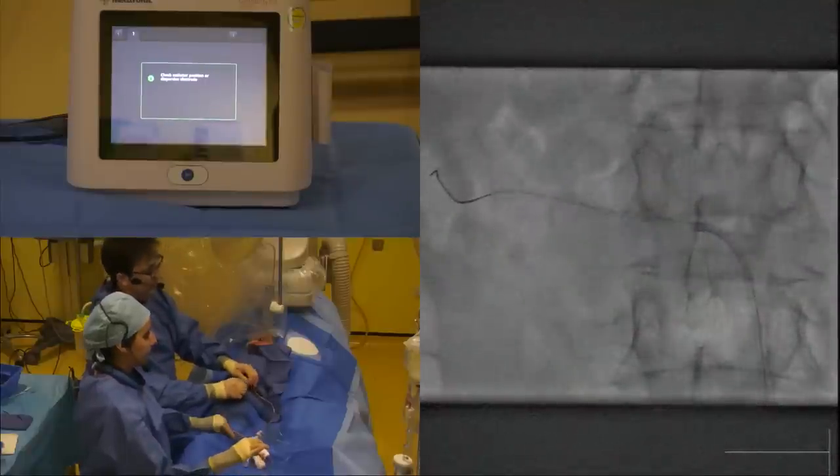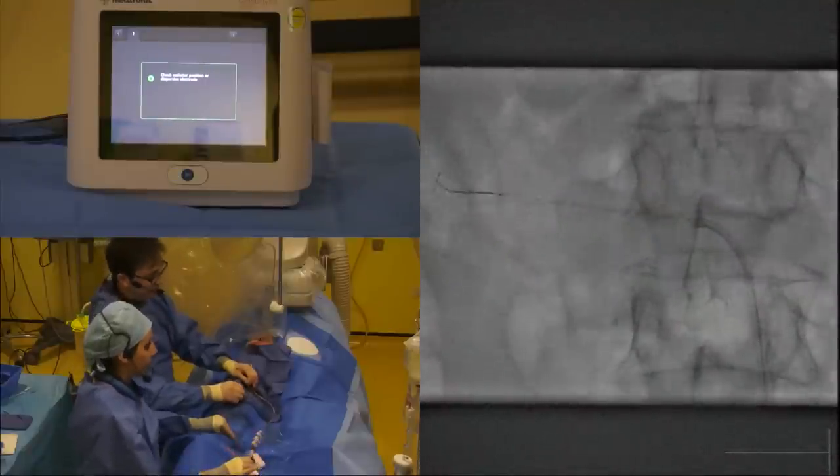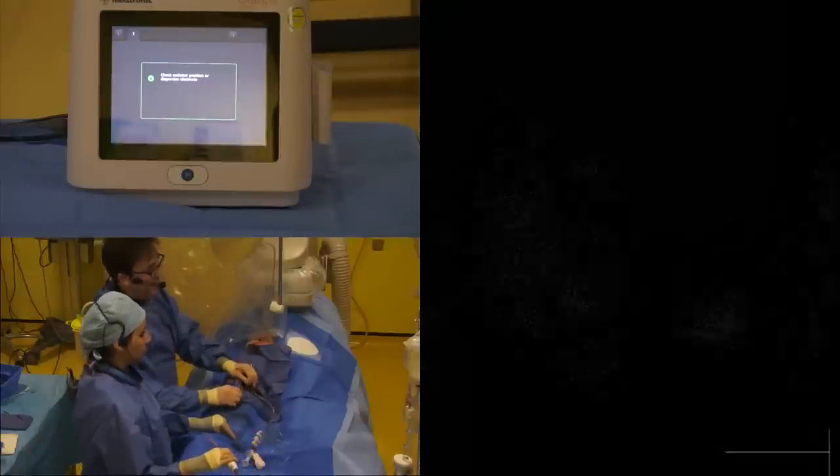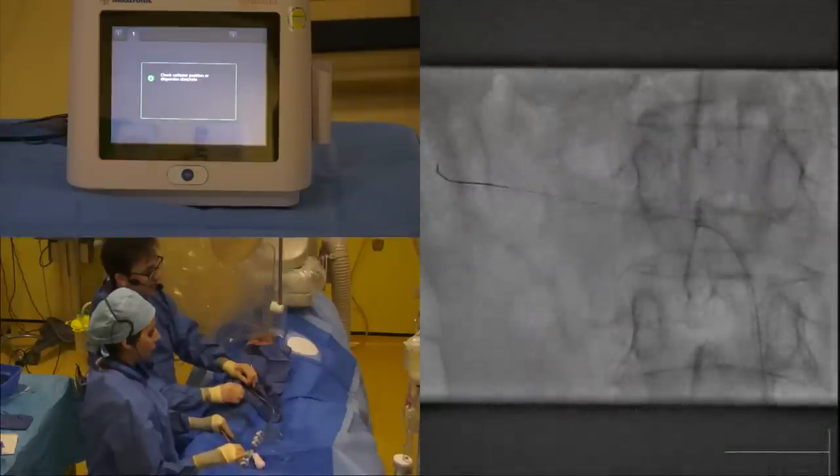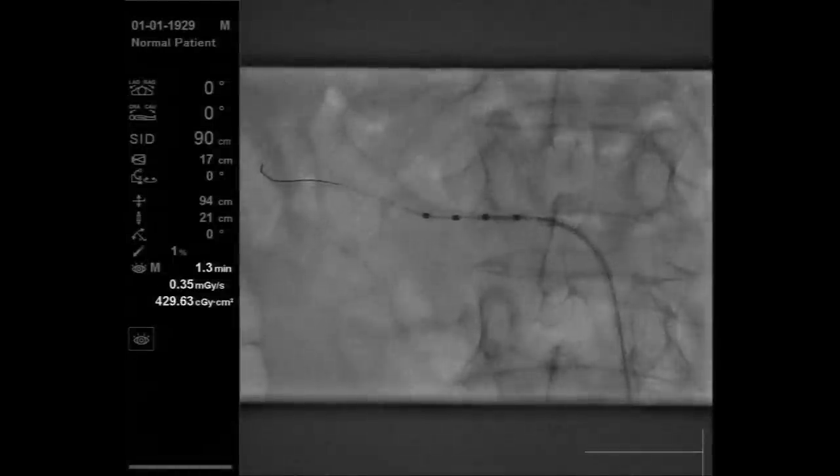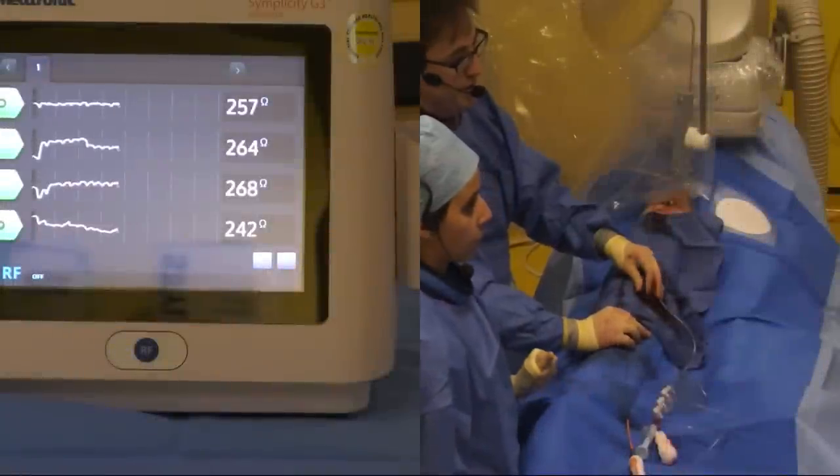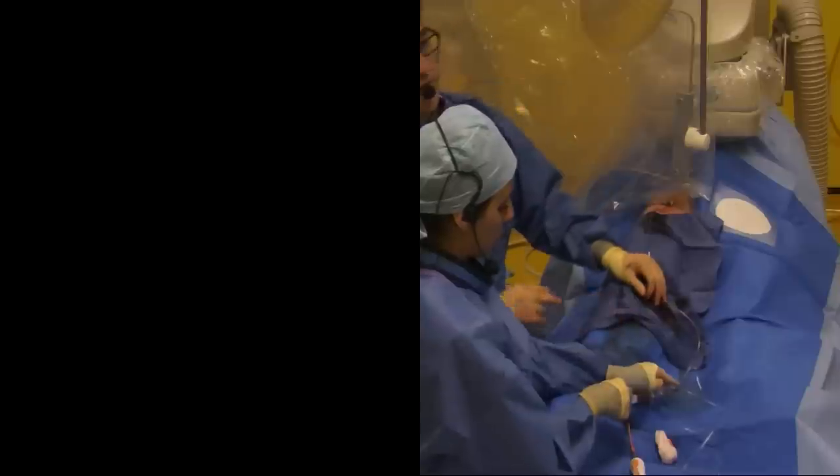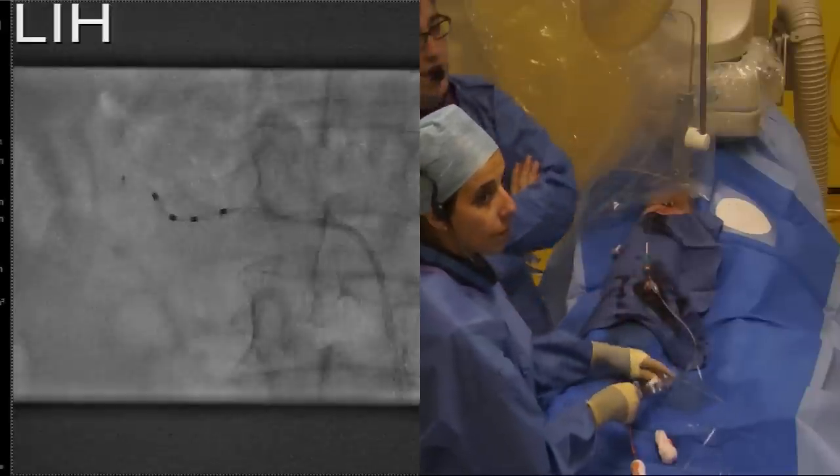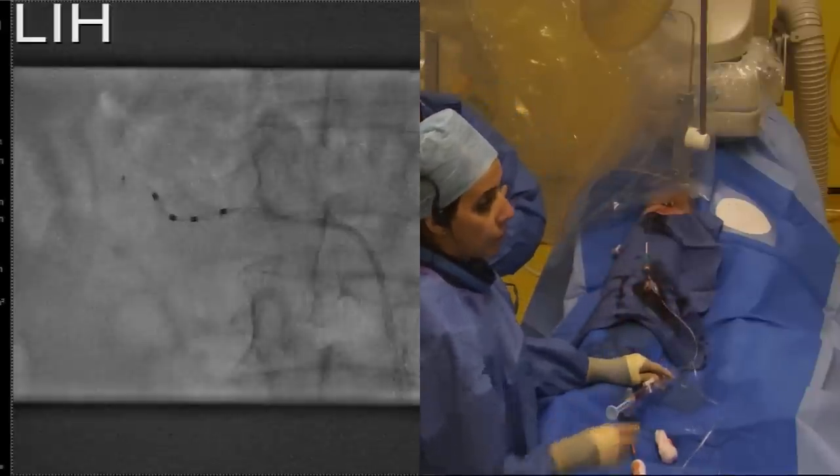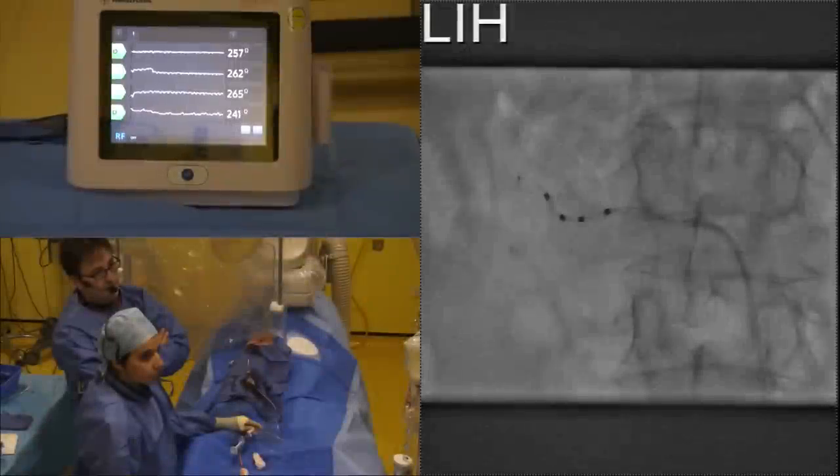I'm just being very careful to watch my distal wire position here. You can see this time it's got out beautifully smoothly. I'm going to advance to just by that bifurcation and I'm just going to withdraw the wire and you can see it's taking that nice shape. We can see the electrode impedance values there.